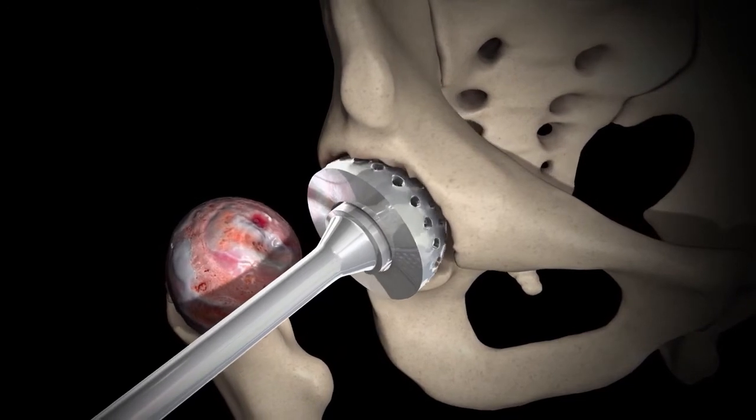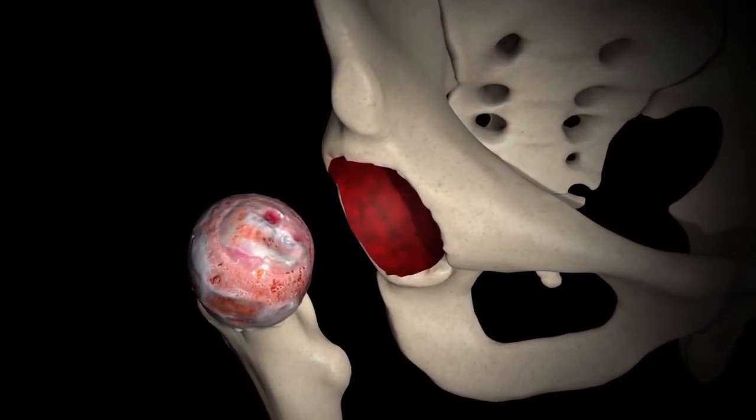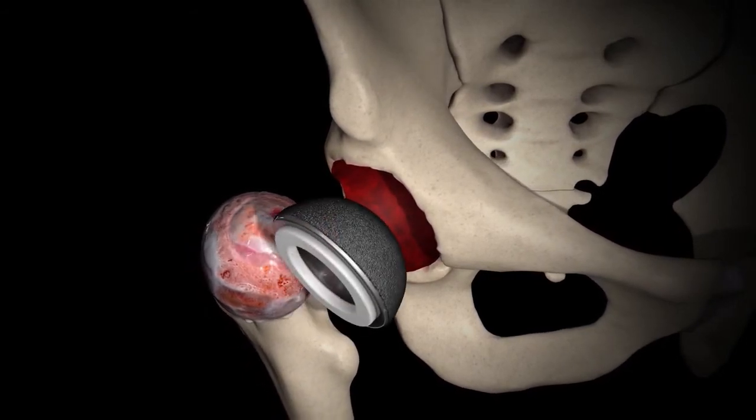The acetabulum is then shaped using a reamer, and then a metal cup is placed into the acetabulum. That metal cup is going to be the backing. The liner, which is a plastic liner, gets locked into that backing — the acetabular cup.